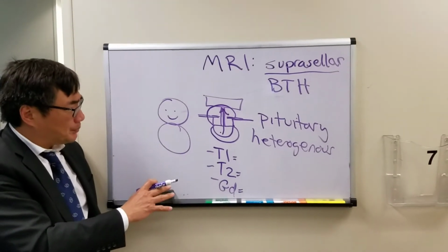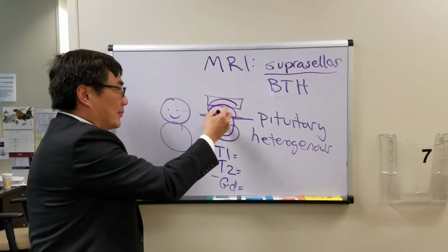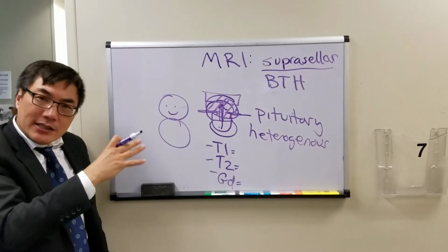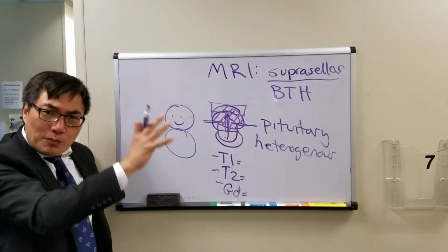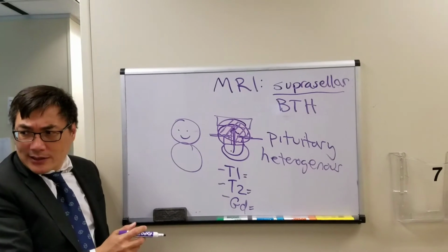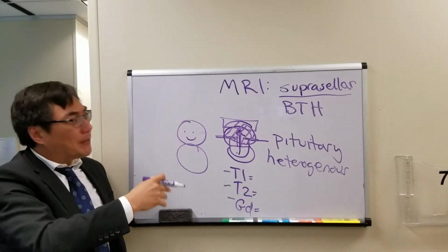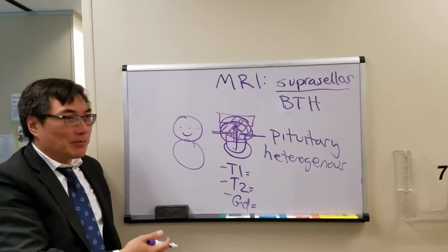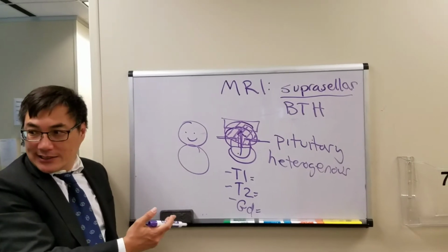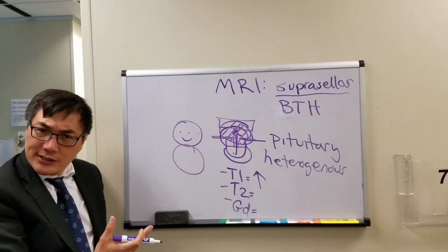In contrast, a craniopharyngioma is usually suprasellar. It doesn't arise from the sella because it arose from the suprasellar space and has embryologic origin in the Rathke's cleft. The cells there grow up and press on the chiasm. But because the craniopharyngioma is part cranio and part pharynges, it will be heterogeneous in its signal as well, and will have hyperintensity where the proteinaceous cyst is.